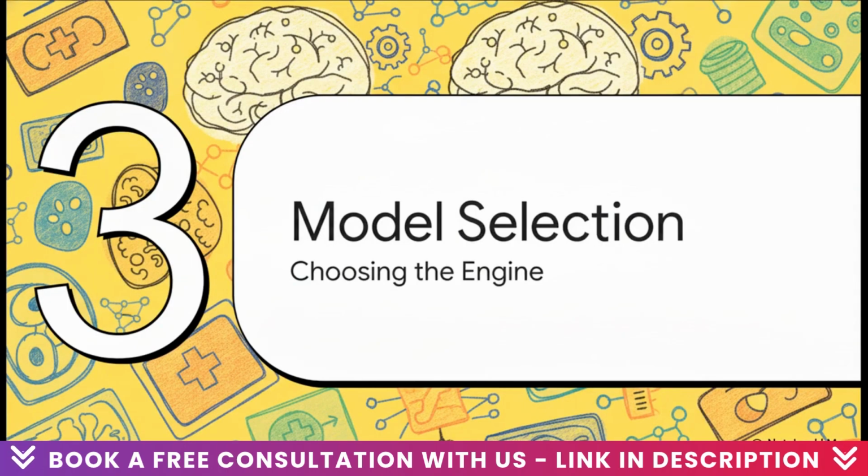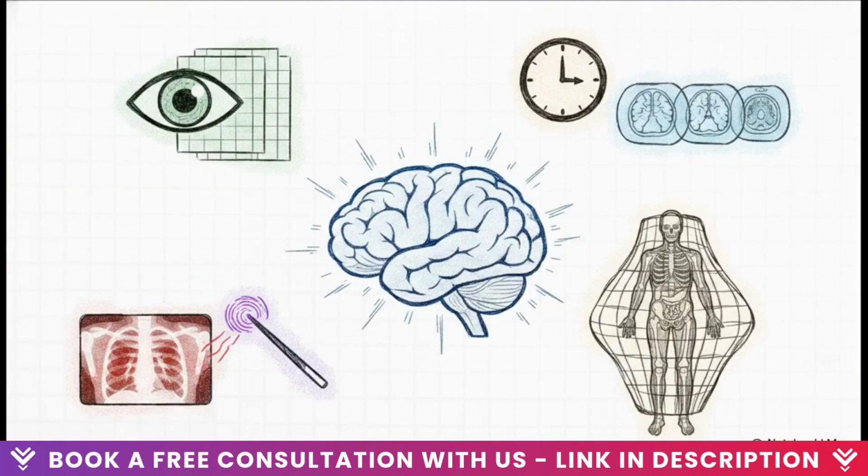Moving right along to step 3, model selection. Choosing the engine for our AI. The field relies on a few architectural heavy hitters here. The absolute foundational backbone is the CNN, or convolutional neural network. CNNs are brilliant at scanning an image and extracting spatial hierarchies, so starting with really simple edges and textures and building all the way up to complex shapes like organs.